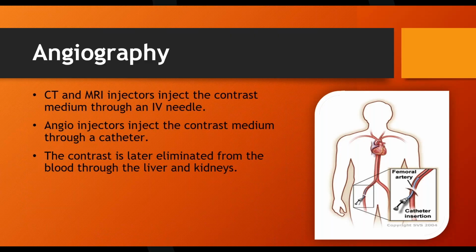CT and MR injectors. All right, here we go. For CT and MR systems, they use an IV needle to put the fluid in the patient. It can go to the back of the hand here, things like that. For angiographic procedures, I think I'll talk about why in just a little bit.